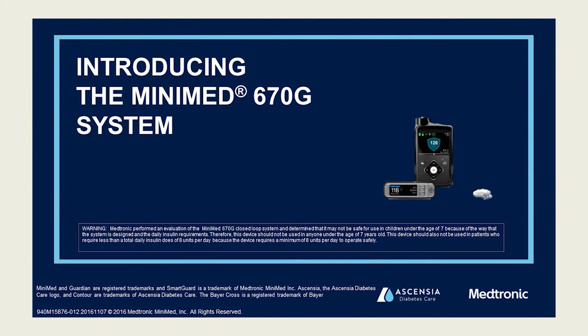the closest we are right now is a single system that has approval for the hybrid closed loop. This is the Medtronic system. So their sensor, when you're in auto mode or hybrid closed loop, adjusts the basal rate based on what your blood glucose values are to help maintain you in a target range. So bring your blood sugar down if it's high, bring your blood sugar up if it's low. And it can only bring your blood sugar up by stopping insulin, it can only bring it down by giving more insulin. So this was the first FDA approved.